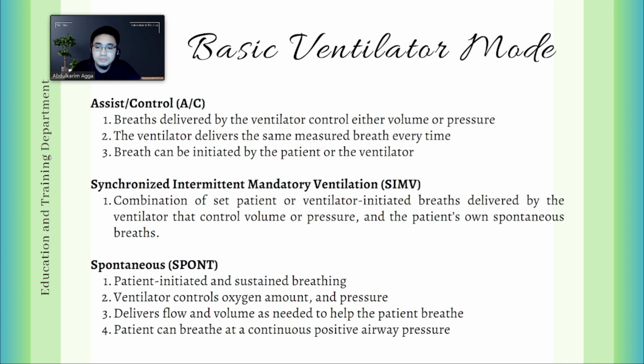Lastly, you also have your spontaneous mode. This is patient-initiated and sustained breathing. The ventilator controls the oxygen amount and the pressure being delivered, and delivers flow and volume as needed. Again, the keyword there is spontaneous: as needed to help the patient breathe. Also, the patient can breathe at continuous positive airway pressure. From the word spontaneous, as the patient needs to be supported, the ventilator comes in to support the patient's breathing.